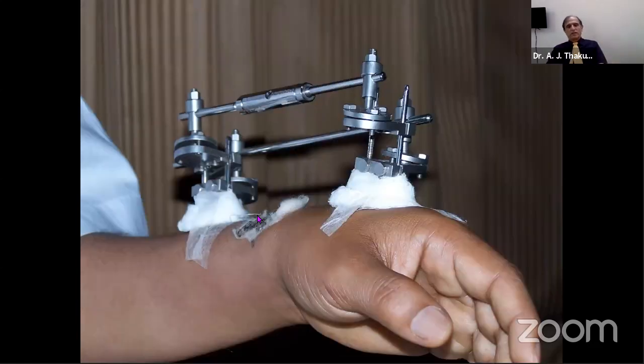I have been following this method between these clamps that I use regularly. I put down gauze pieces and just go round and round till they become very tight, and just hold them with the external fixator. Of course, my pin care starts with applying a tincture benzoin seal at the pin skin junction. When it dries up, it seals the whole thing tight, and there is no issue there. And with these two gauze piece rolls, which are tied round and round, I am able to control the movement, and it has worked very satisfactorily.